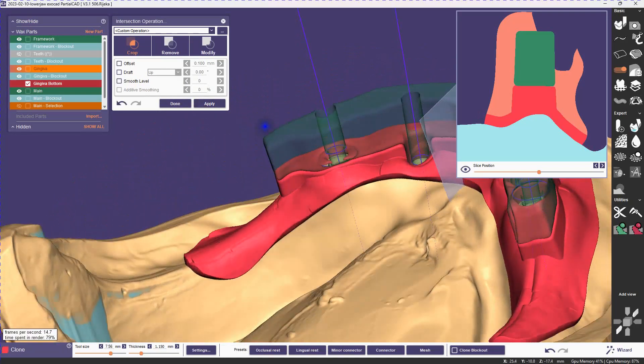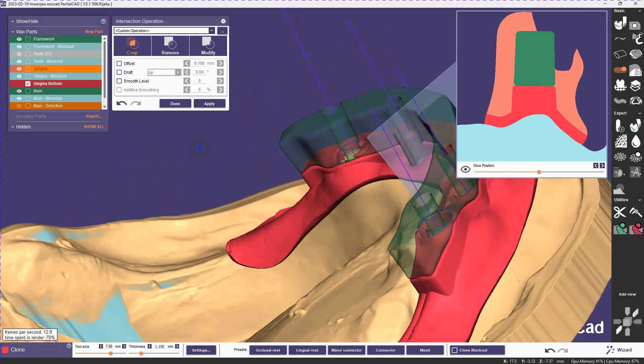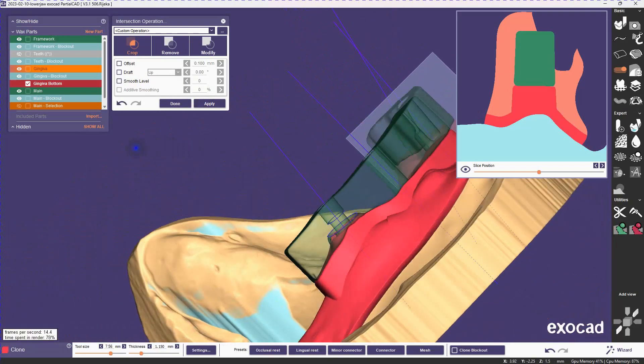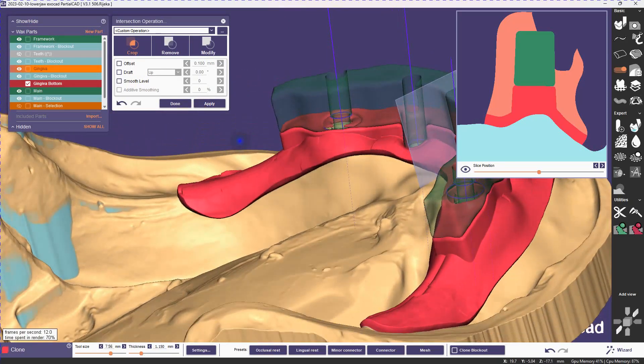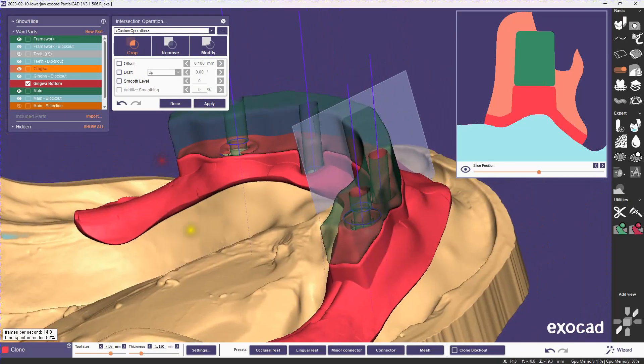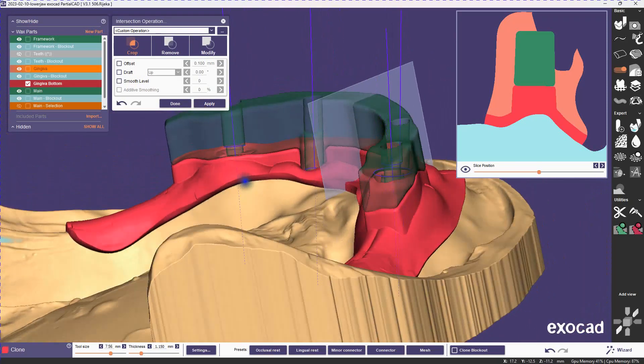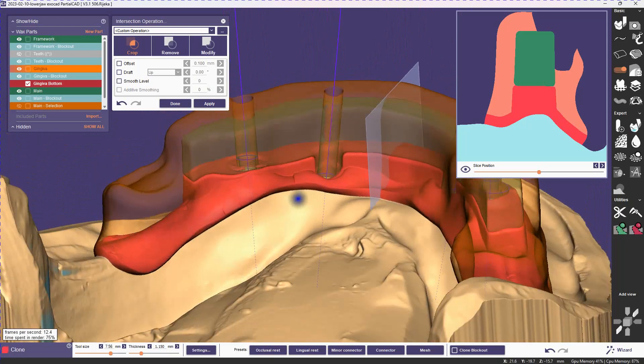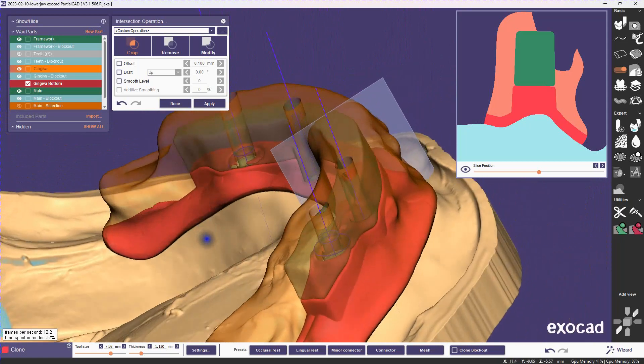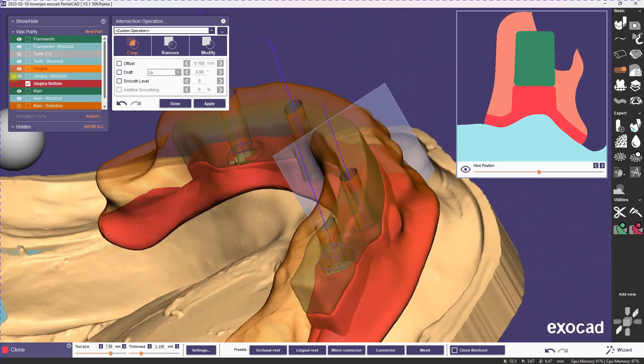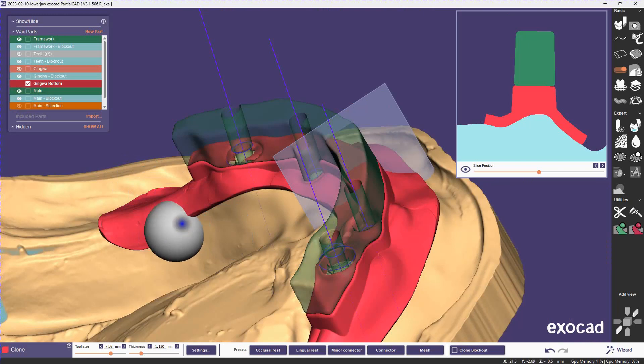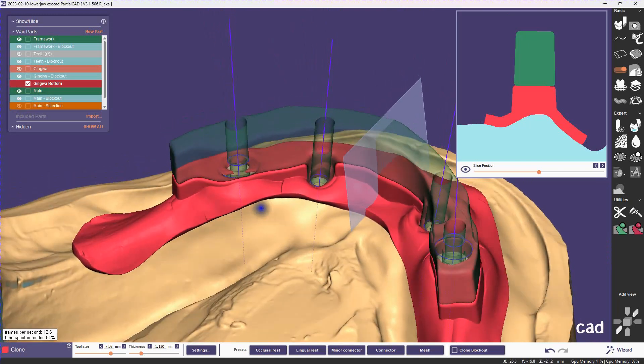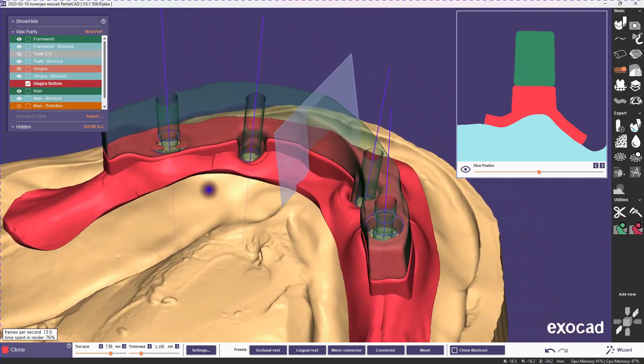So again we could be done at this point, but there's one other thing I'd like to show you. We currently have the teeth going down to the bar and cutting all the way through the gingiva, and I want to make something that looks a little bit more like a regular tooth pocket.